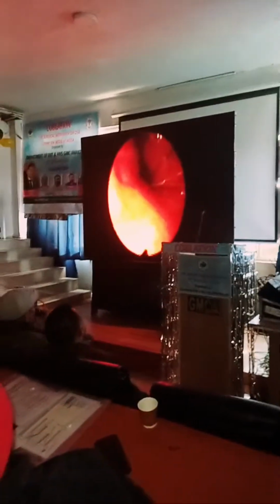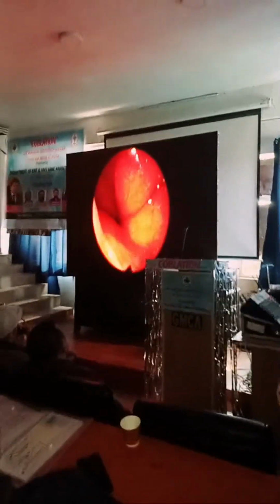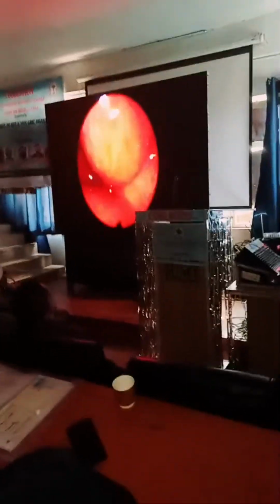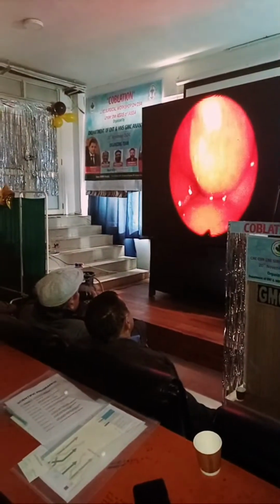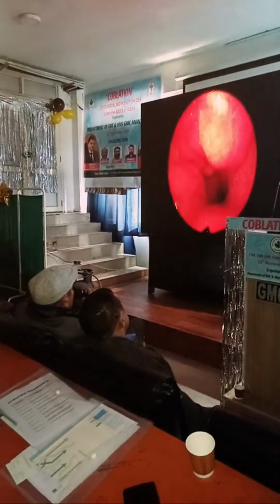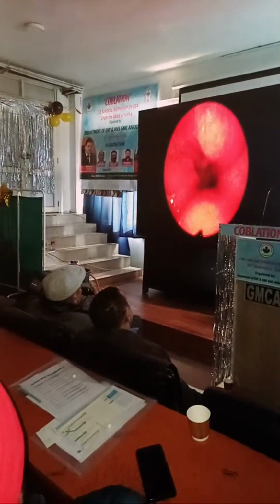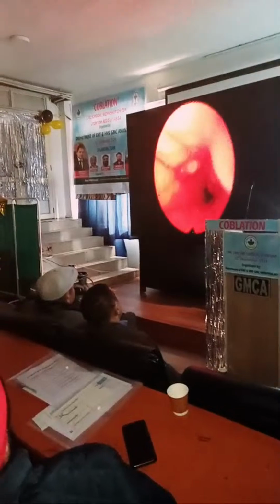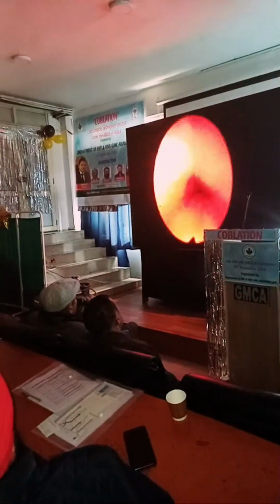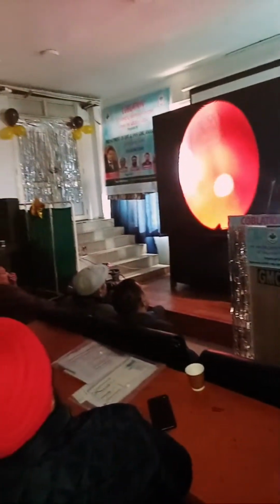Yes, we can see the palate now. Yes, we can see the lateral collapse. This is the salpingopharyngeal fold. You can see a little bit of adenoid, which is not too much, but there is salpingopharyngeal fold hypertrophy. Now I am in the lateral collapse.